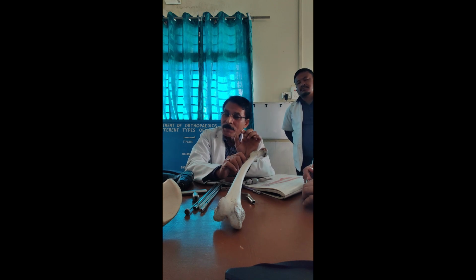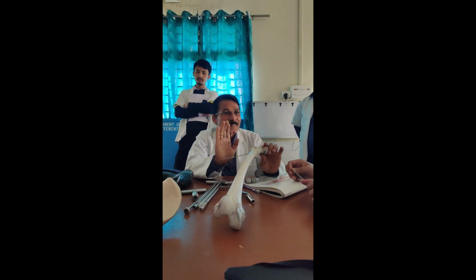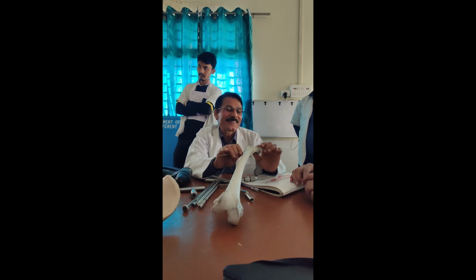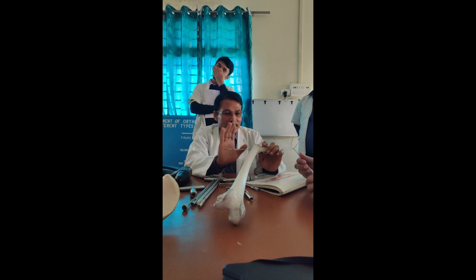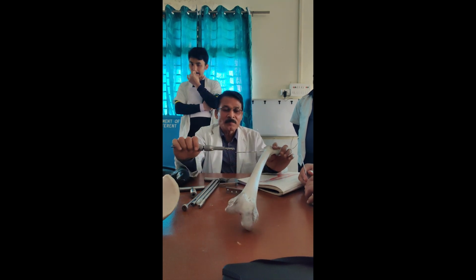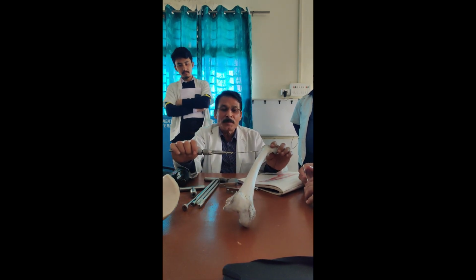It is said in osteoporotic bone you go 5 mm, and in case of strong bone you can go 10 mm. But essentially you are supposed to lock at the subchondral bone area. It is a very strong bone, and if it is locked there, displacement chances are less. That is why you are supposed to lock it. Got my point? Then the next order is reaming. Now you have to do the reaming.